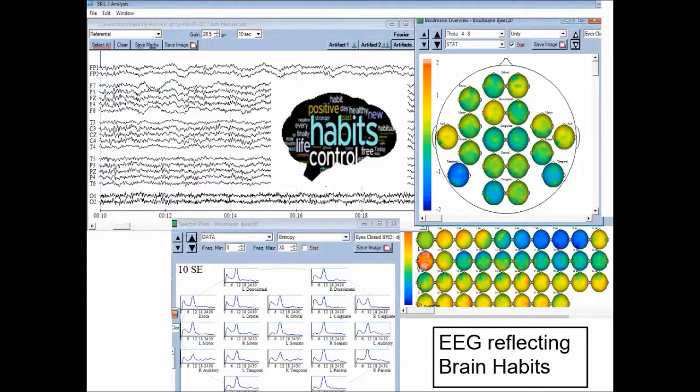So you have all this information, and EEG is very good at moment-to-moment changes: what's going on as someone pays attention, gets fatigued, gets sleepy. But we want the habits. We want the brain habits, because those tell us where the brain leads to the habitual behaviors that can be a problem. And so we're looking for those habits that we can identify and then change. We learn how to change them empirically. We start off with theory, but empirically we find it, so we know how to normalize any site that happens to be messed up.